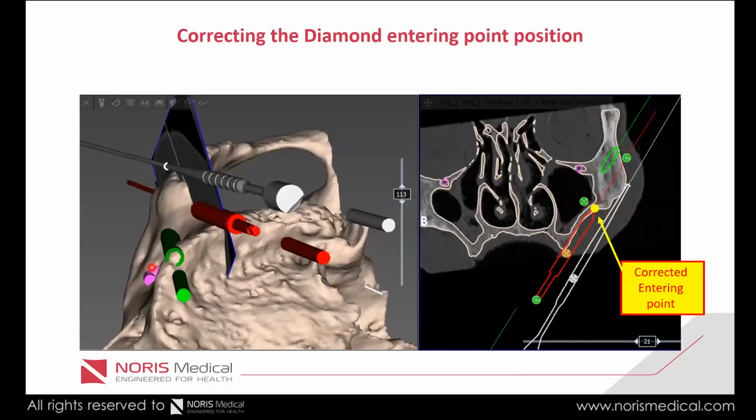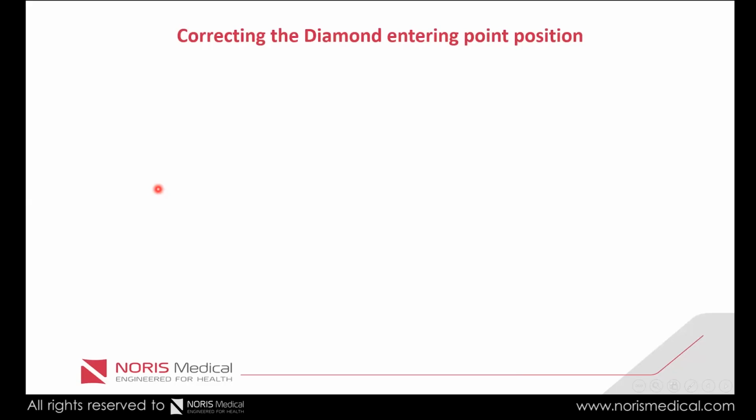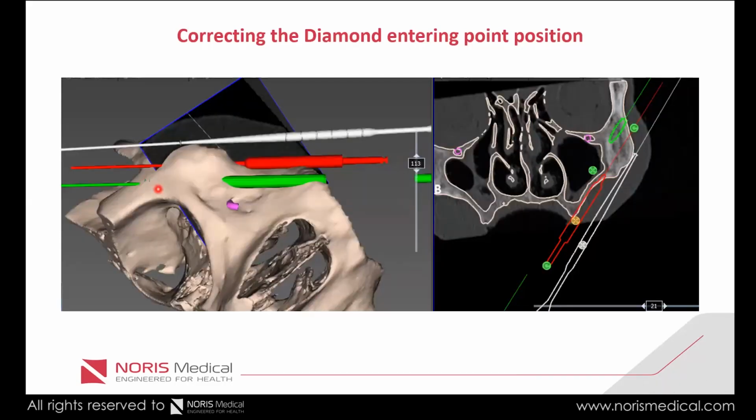So to summarize here, we now know how to enter the anterior implant on the right angle of the orbital angle. We know where to enter the point because we measured the height. We know how to enter a posterior implant because we found the entering point, and we know that we're not going to be colliding because we have the parallel view. This is very important to take home.